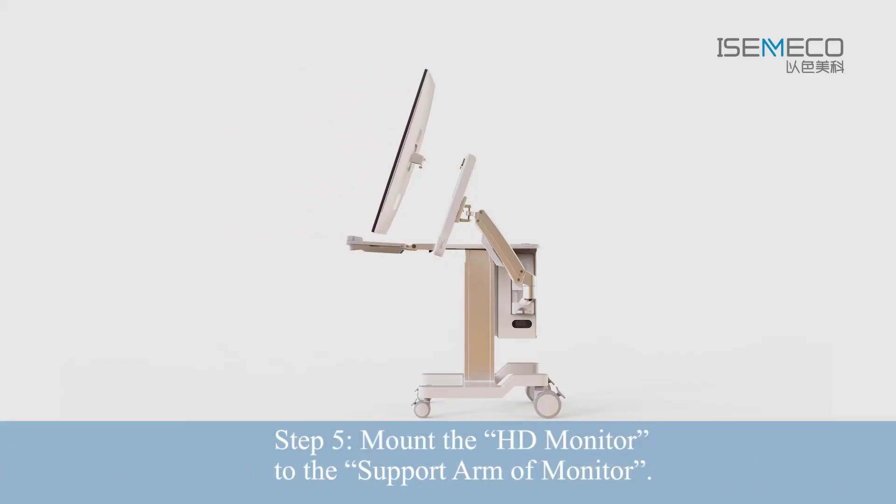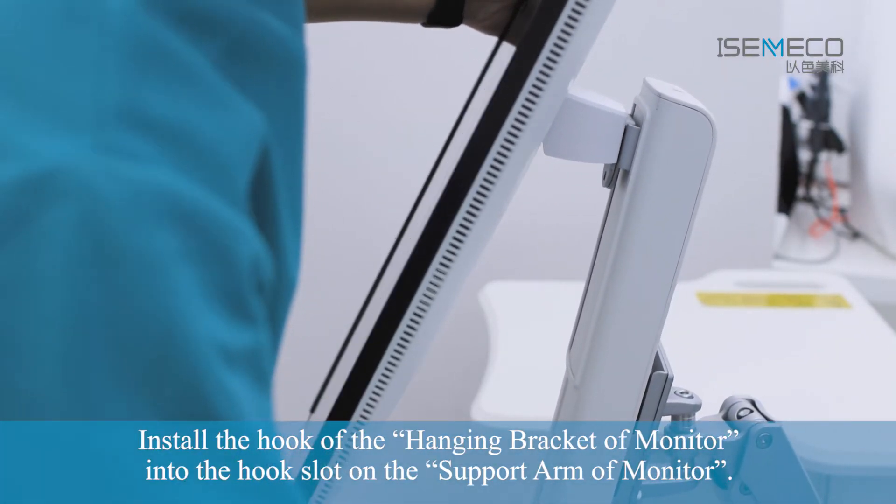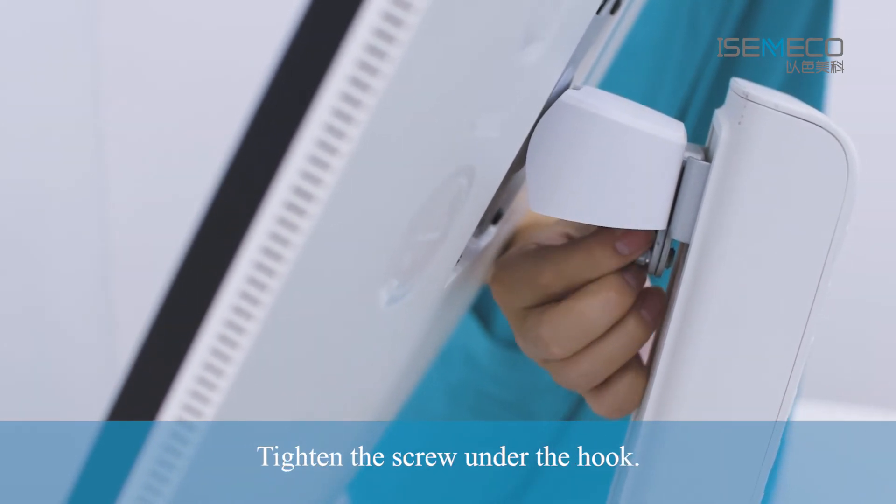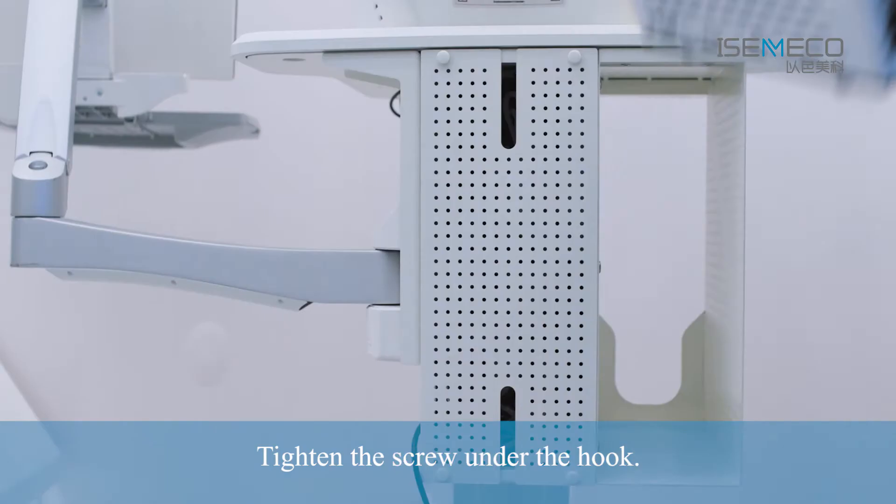Step 5: Mount the A-HD Monitor to the Support Arm of Monitor. Install the hook of the Hanging Bracket of Monitor into the hook slot on the Support Arm of Monitor. Tighten the screw under the hook.